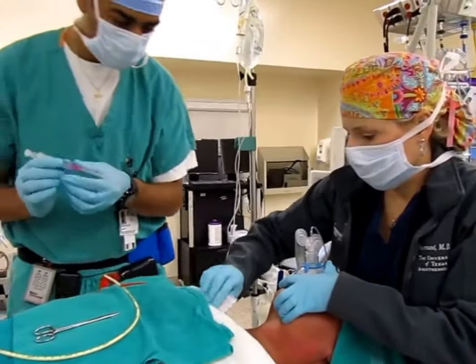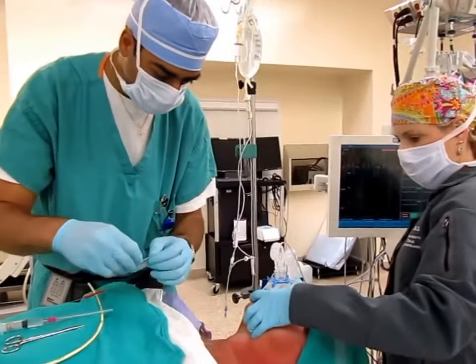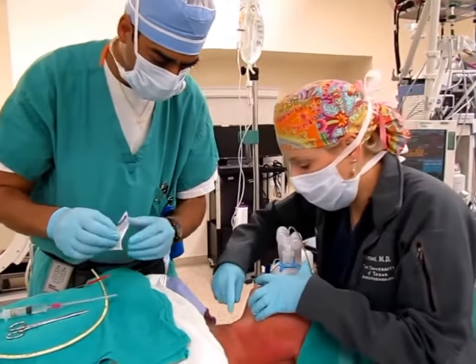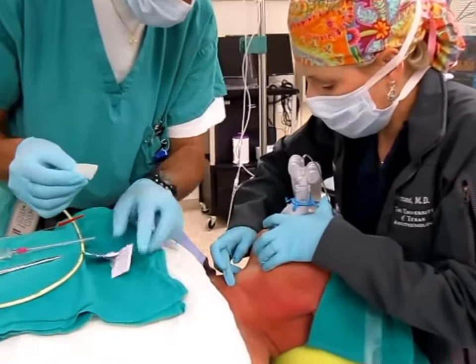This is your alcohol swab. Walk down from the thyroid, partly. That's the laryngeal prominence, and you can feel an indentation right there.